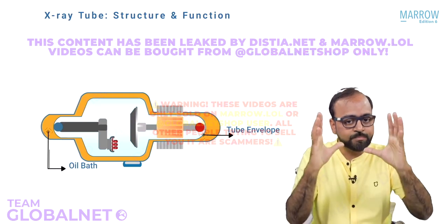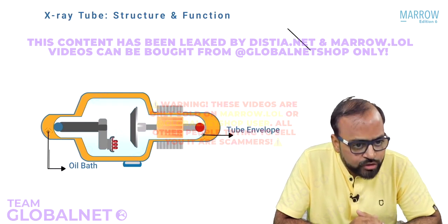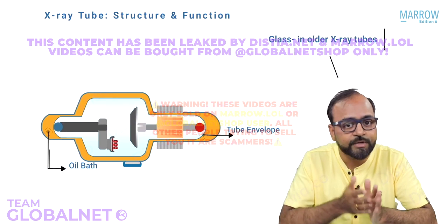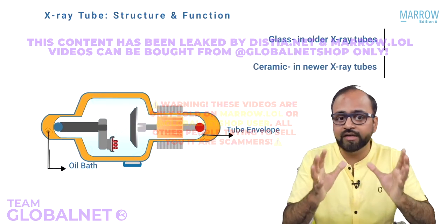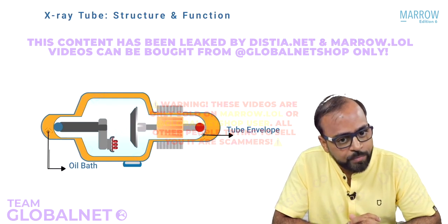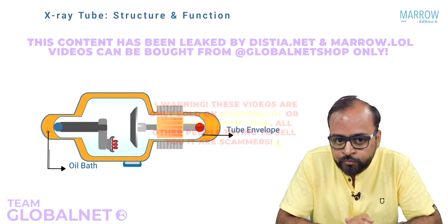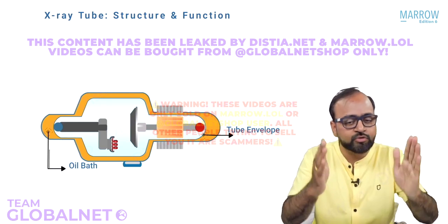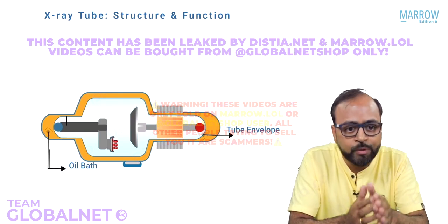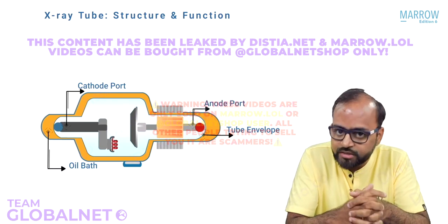Inside that oil bath is placed, as we discussed, a tube envelope. This tube envelope is made of glass in the older X-ray tubes. In the newer X-ray tubes, it is made of ceramic. Again, it has a very high heat loading capacity; heat tolerance is very high. Now let us open up the tube envelope also, and you'll find that in the tube housing and tube envelope there are certain ports for attachment of electrodes. One is called the cathode port, one is called the anode port. That is where the cathode and anode connections are going to be made.